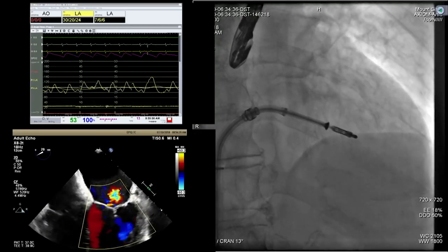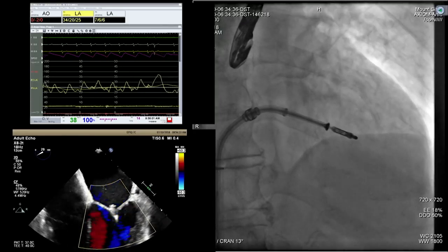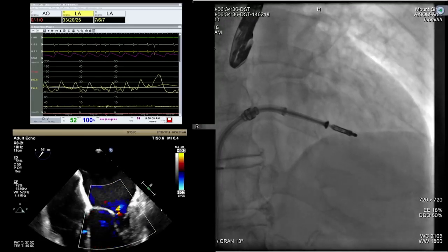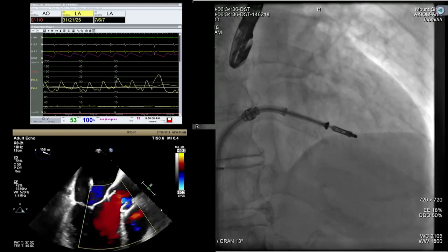Yeah, offline. We have some MR lateral to the clip. Okay, go release that now. We are ready to release them. Did you measure the length, Gila? Focus on this, just the difference that I think Philip was mentioning.